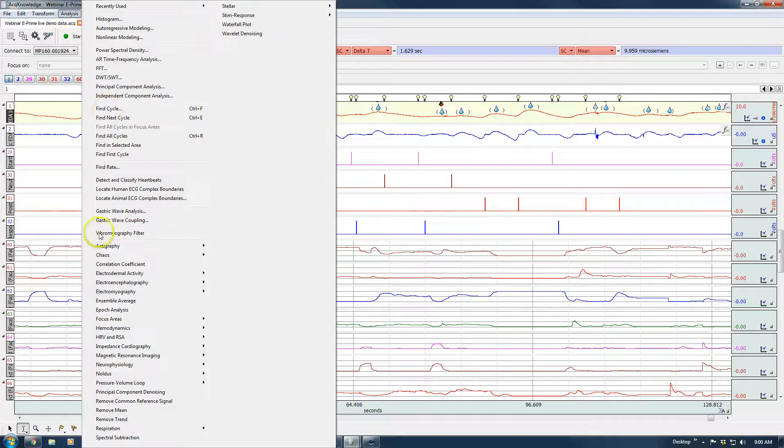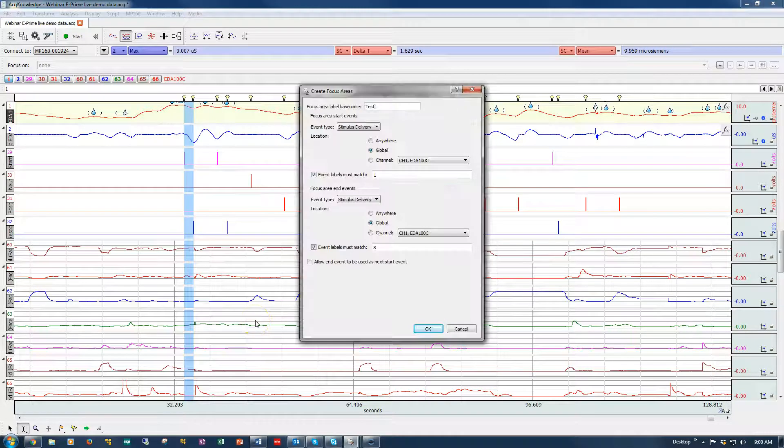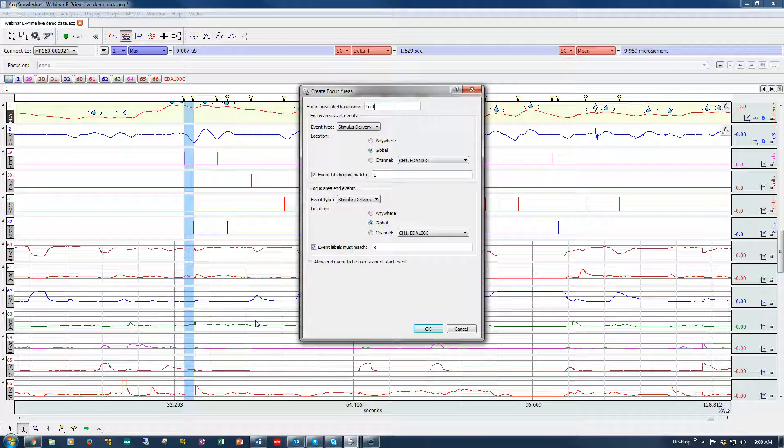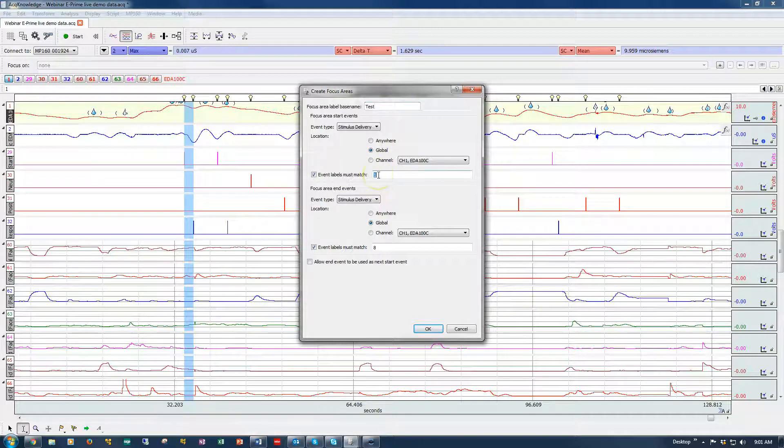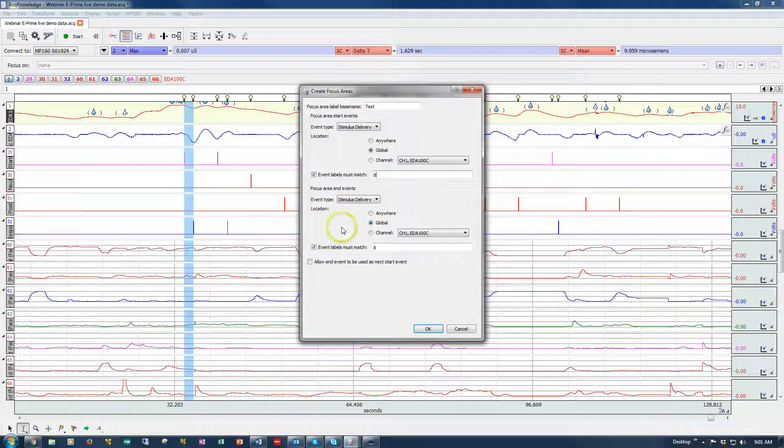So now we're back to where we were. I'm going to come back into the Analysis menu, Focus Areas, Define Between Events. Only this time, I'm going to select intervals between the participant responses. So I'm going to identify the first stimulus delivery with a label 8 and then I'm going to go to the next one. And the system will create focus areas from one stimulus delivery with a label of 8 to the next.